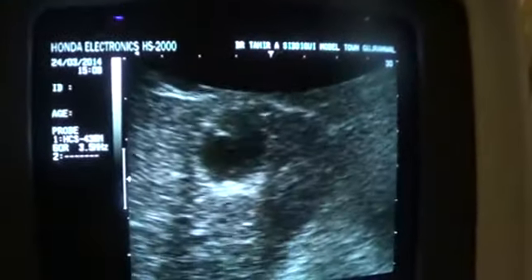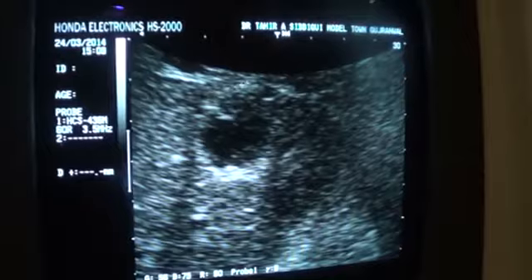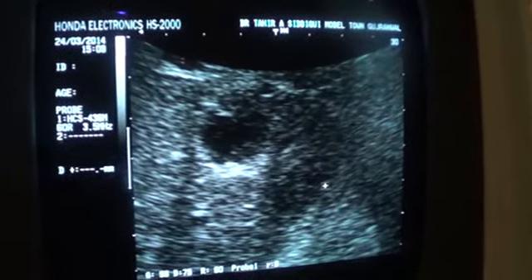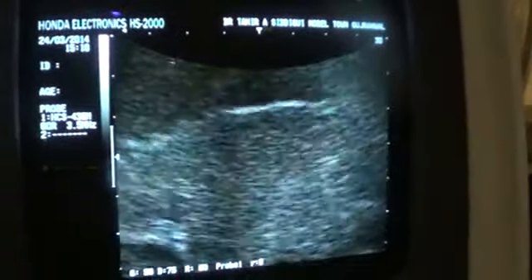Thirdly, the cyst is not clear internally. It has tiny septa within it, and is surrounded by a thick wall. And you can see the critical angle shadow. This is a critical angle shadow from it. So this is a complicated cyst or a focal lesion in a cirrhotic liver.